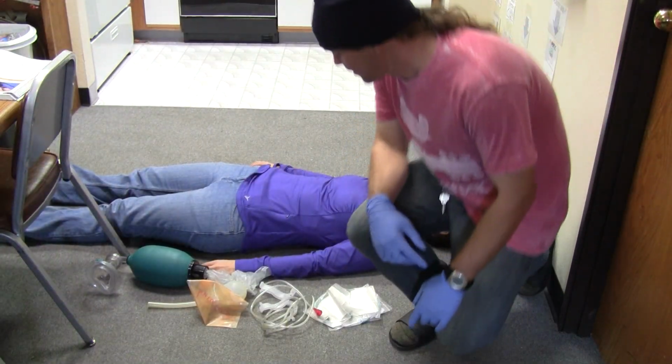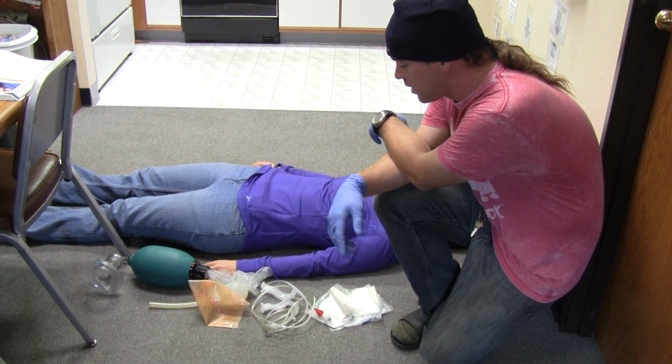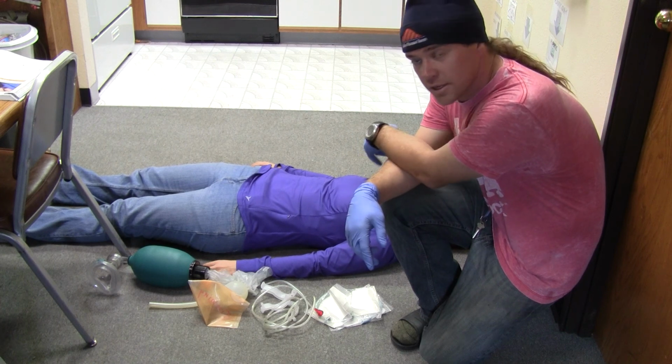Hi, this is Zach and Katie with Alpine Rescue Team. Today we're going to be going over airway management, suctioning, BVMs, OPAs, and NPAs.